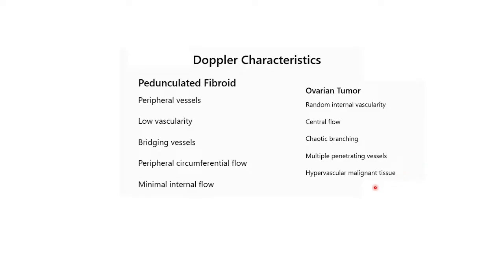It is hypervascular if the lesion is malignant, cancerous. You can see the differentiation in the Doppler characteristics.